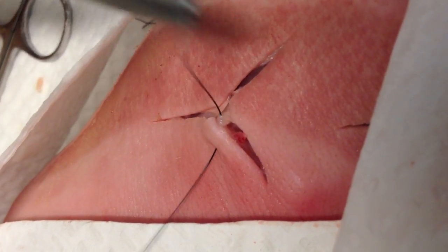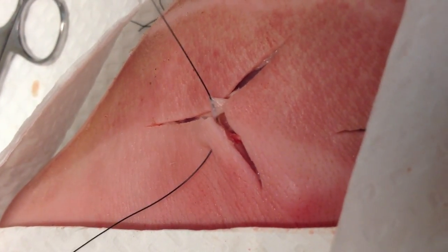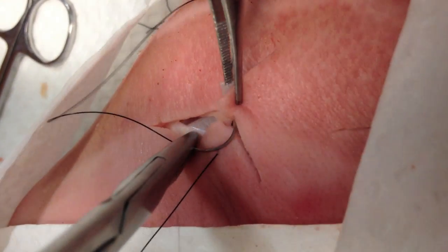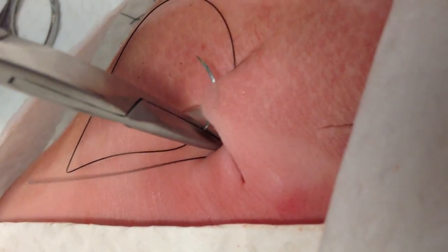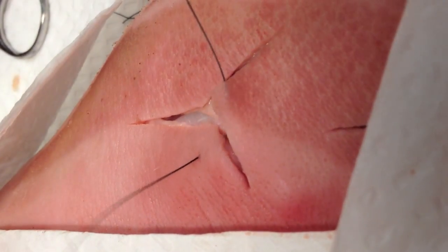The first step is to go percutaneously through one edge of the tissue. I typically reserve the edges that are most flap-like — the ones that come apart the most — for where I'm going to place the subcuticular layer. We're going to drive this second throw through the dermal layer and out the dermal layer of that flap edge, basically never piercing the epidermis. And that's going to catch the flap edge.